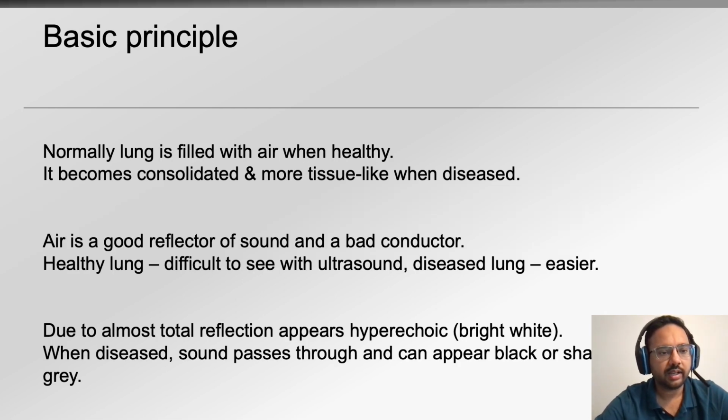The basic principles in lung ultrasound are that normally the lungs are filled with air when they're healthy. When the lung becomes diseased, it becomes consolidated and more tissue-like. But why is this important? It's important because when ultrasound was being used for other organs, around the 80s it was thought to be a useless tool for the lung because air is a good reflector of sound and a bad conductor. Especially in a healthy lung, it's almost impossible to see anything inside with the exception of the pleura.